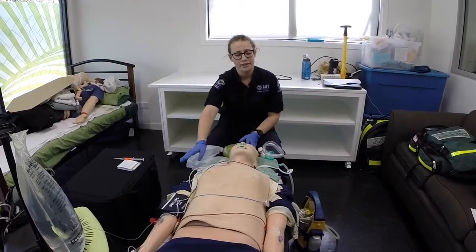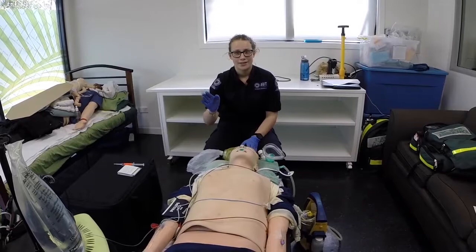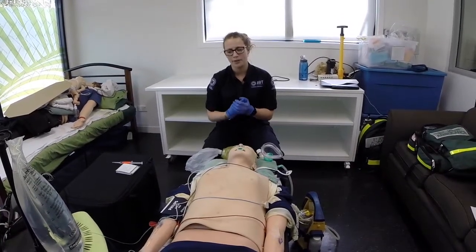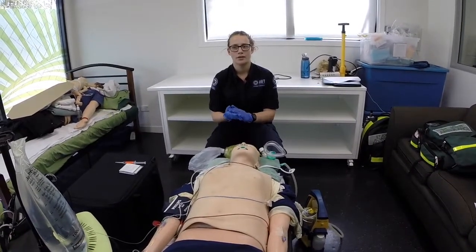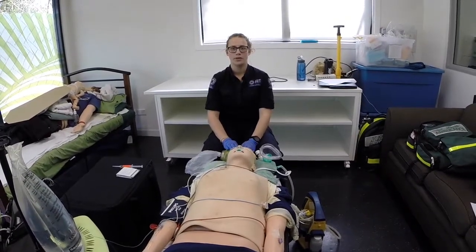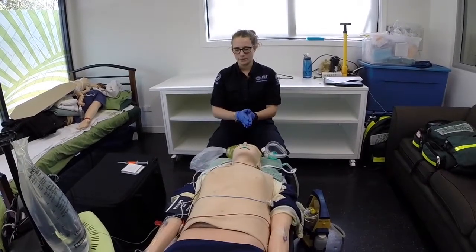In one ACF, we've got a primed line of sodium chloride, which my offsider has drug checked. However, it is not currently running as the blood pressure has not dropped below 120 systolic. If this does occur, we will titrate to effect.